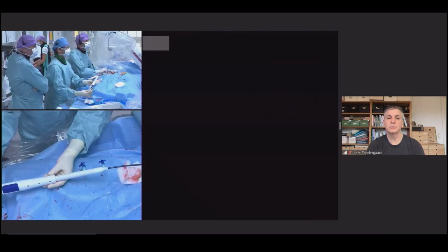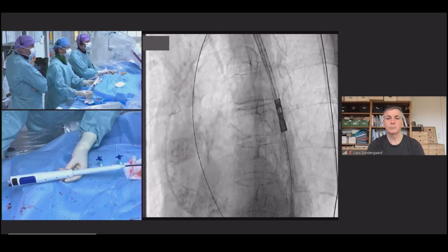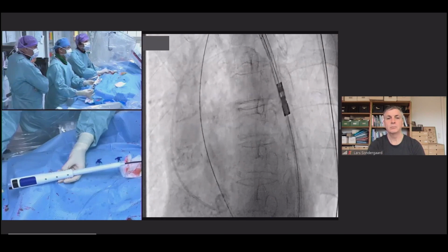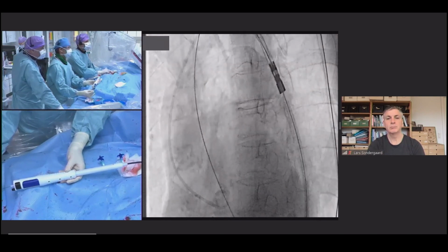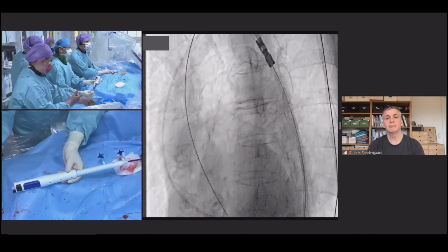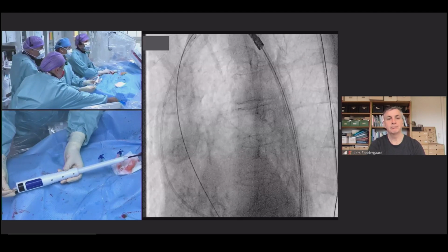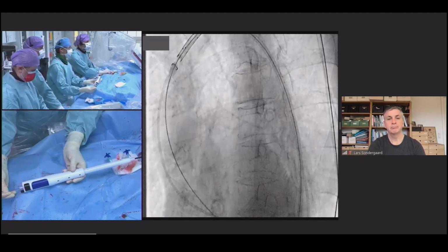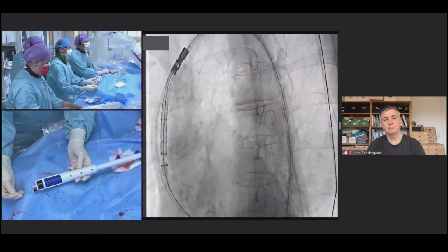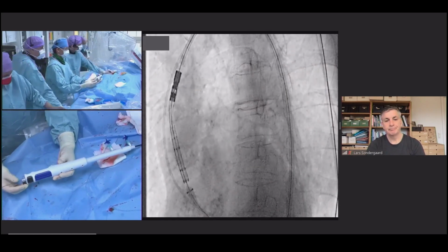All right, ready? Ready. I'll go slowly here. And often you will see that small kink on the stent frame. Yeah, we'll finally make that small kink there. Feed the wire a little. It's okay, it's okay. I'm giving you some negative rail. Yeah, so it took the arch nicely, yes. And I'm railing constantly. Okay, now I go to cusp overlap again.